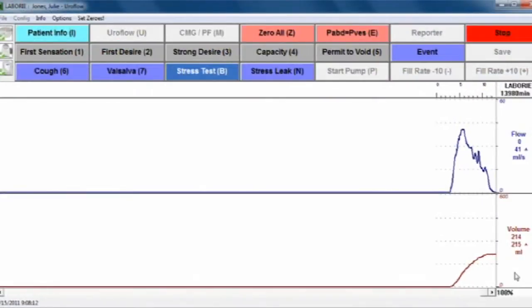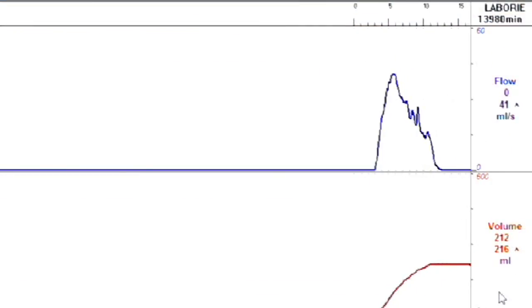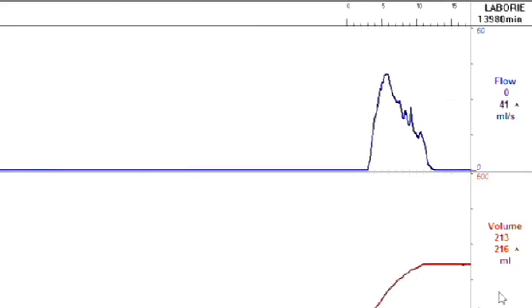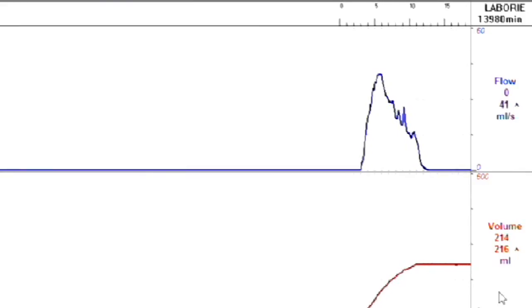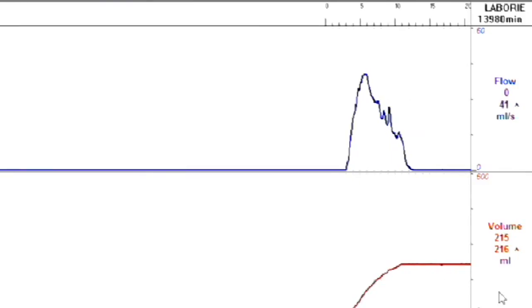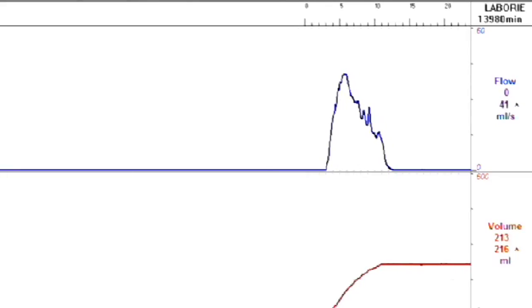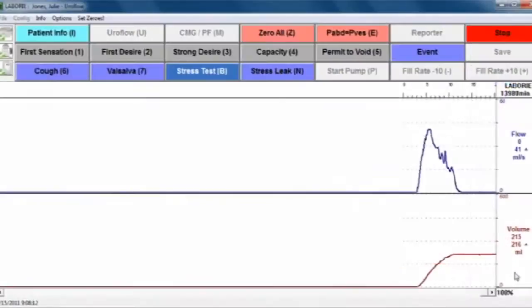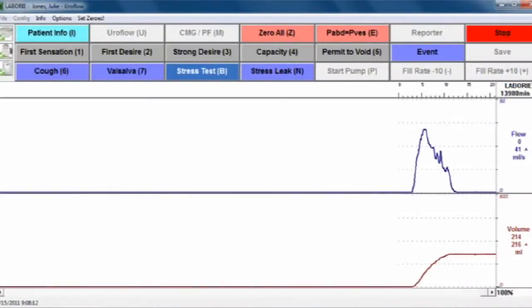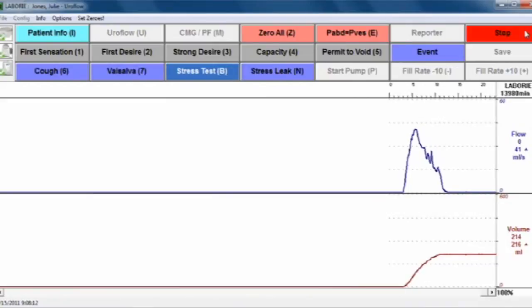Ideally, you want to leave the room so that the patient can void in private. Once the patient has finished voiding, the Uroflow will record for an additional 50 seconds after there is no change in activity in the study, in case the patient starts to void some more.